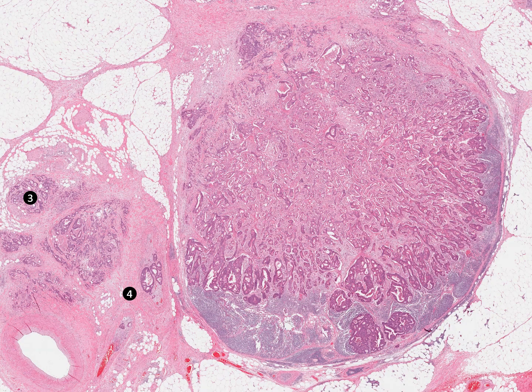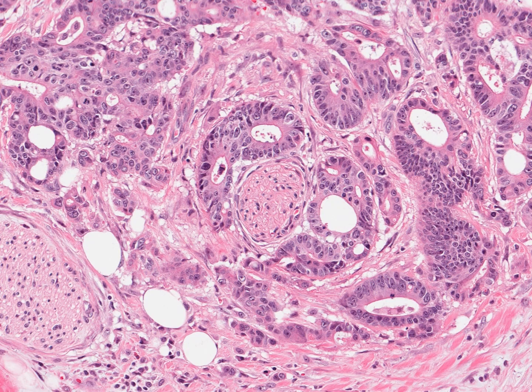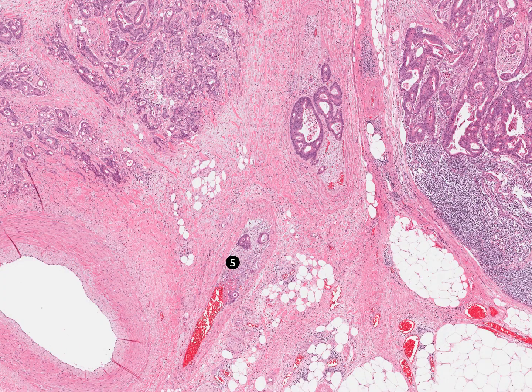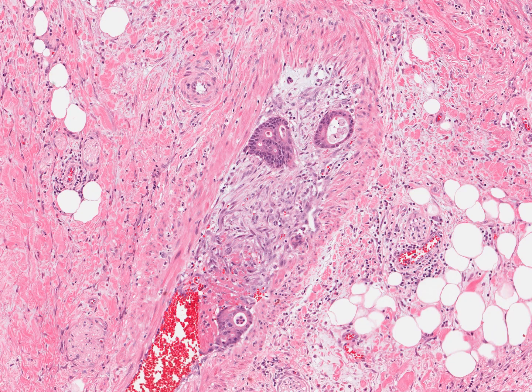At the far left there is a focus of perineural involvement by tumor. Below this focus is extramural venous involvement. About half of the venous lumen is occluded by tumor and accompanying desmoplastic stroma.